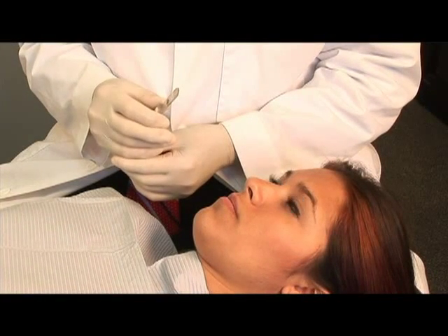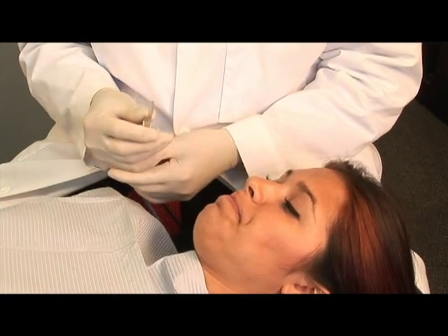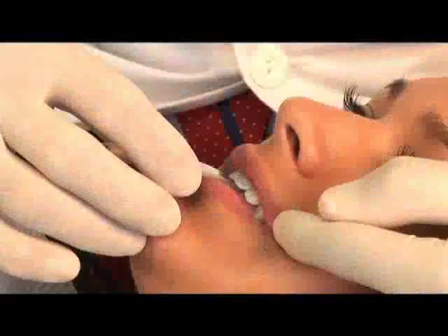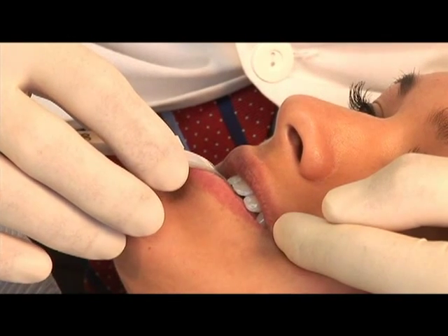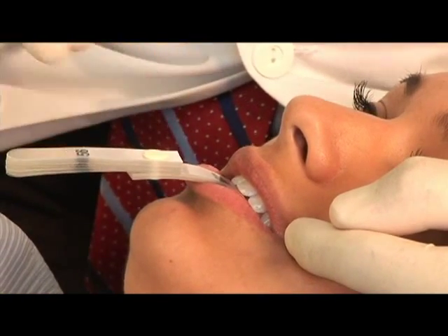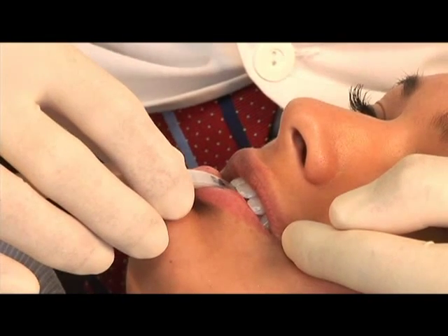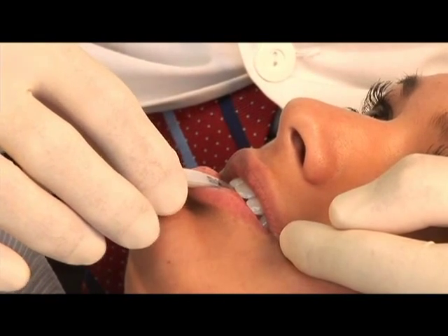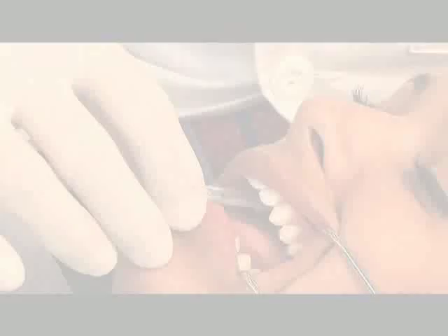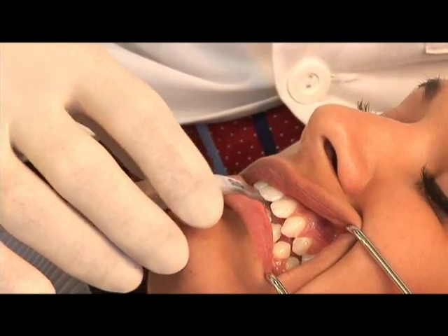To help the patient achieve a centric relation position, use an anterior deprogramming device such as a leaf gauge. Place the leaf gauge between the maxillary and mandibular incisors. Instruct the patient to protrude and then retrude the mandible while closing on the leaf gauge. The retrusion should be until the mandible stops on its own. Do not force the mandible back. Additional leaves are required if posterior contacts are present. Ideal disclusion is 0.5 millimeters in the posterior region. This cycle should be repeated to verify that posterior disclusion is maintained.